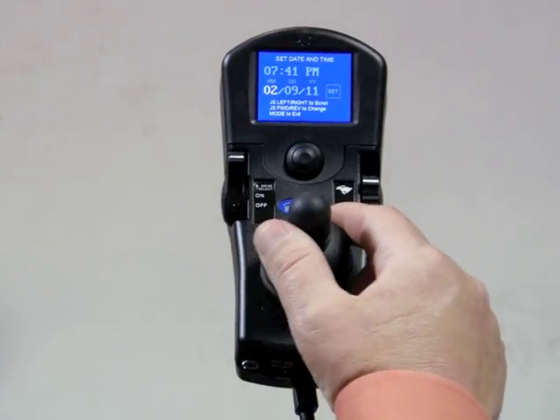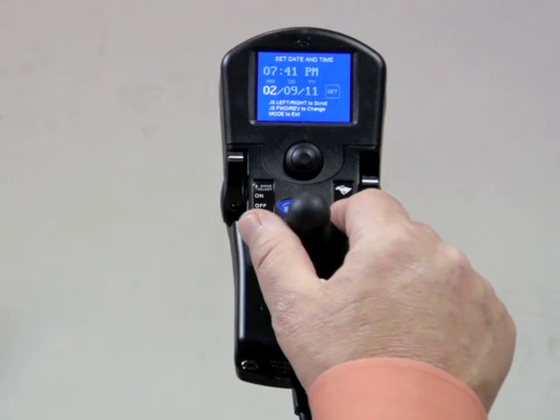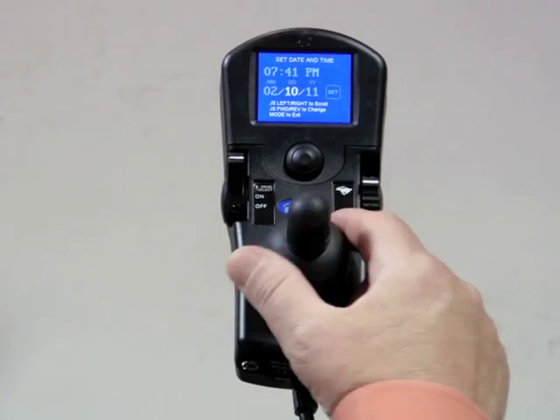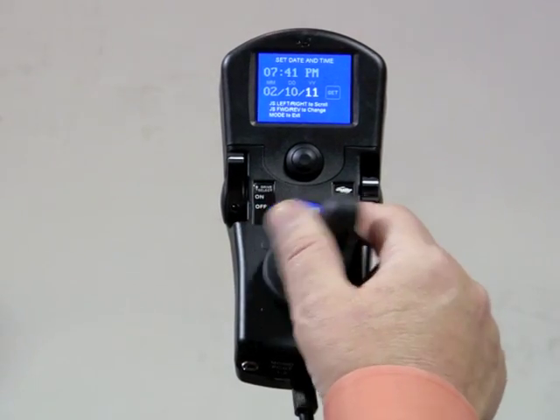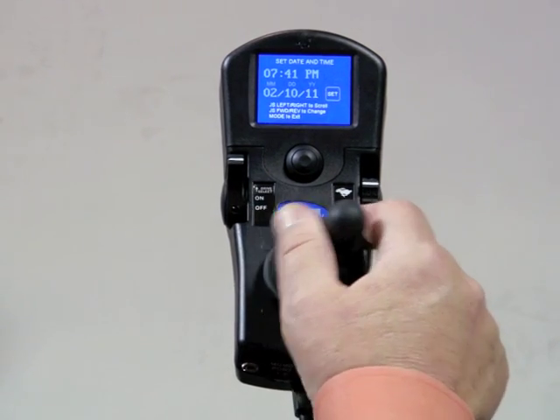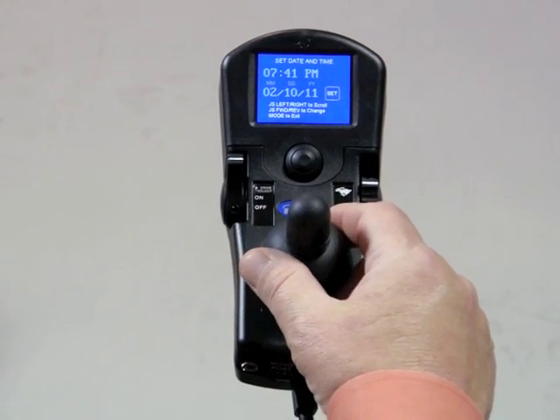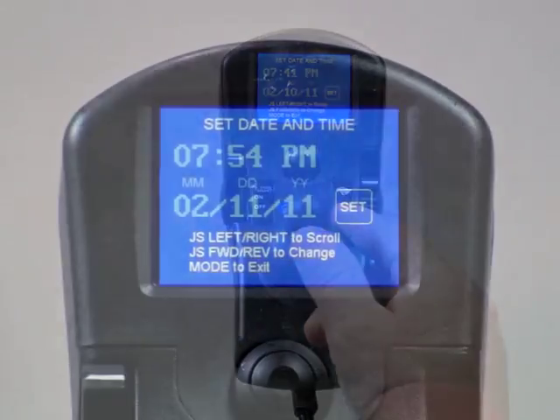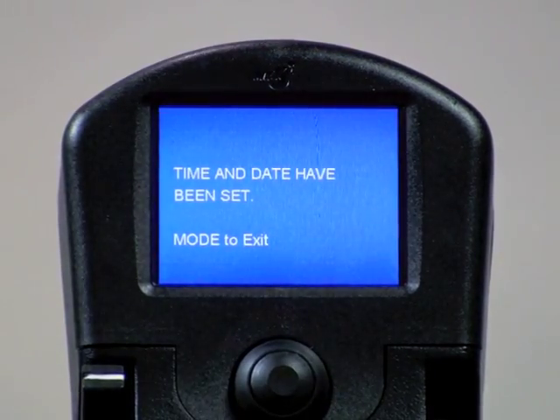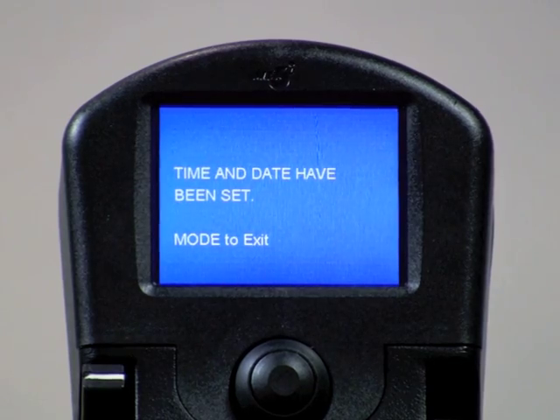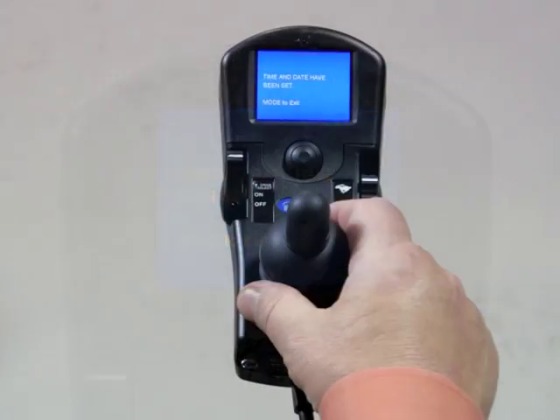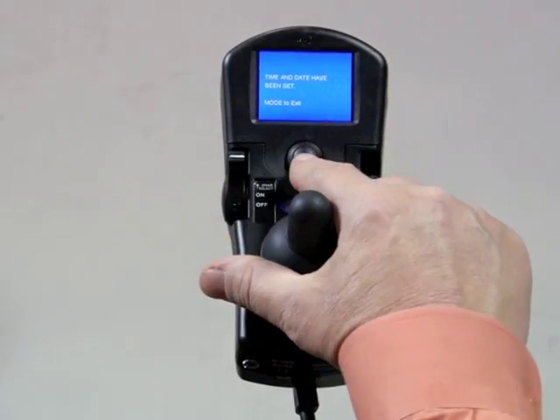A right driver command continues through — set the month, make sure the date is set correctly, and finally the year. When complete, be sure to highlight the set icon and use a forward driver command to accept these changes. You'll see the message: time and date have been set. Use the mode button to exit.